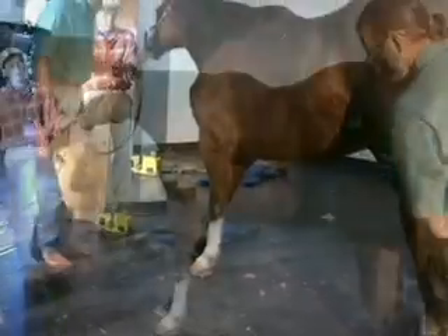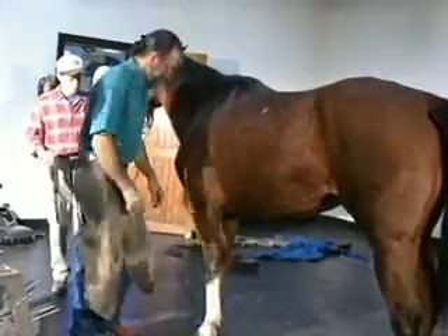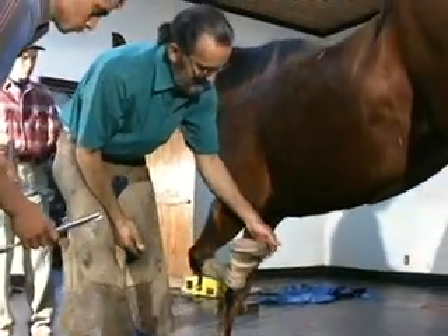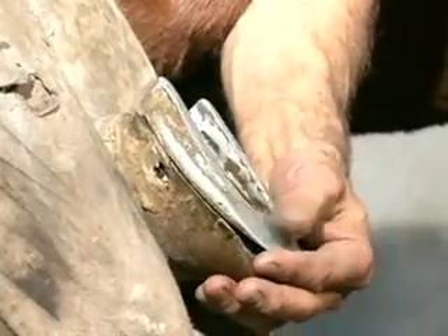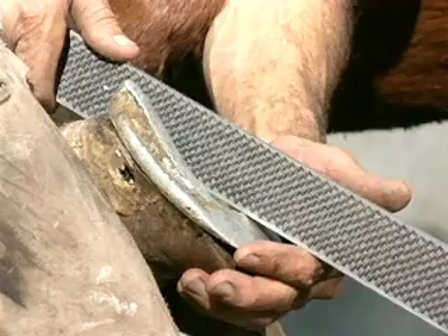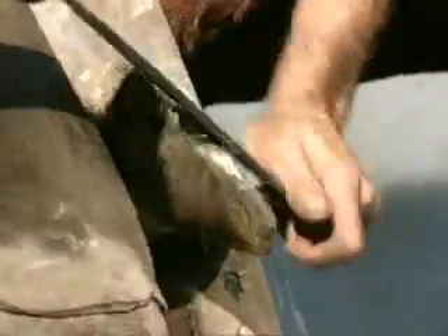Once you've got the first foot shod, I will position the horse so that they can stand directly over the foot. They don't want to do that — pinch the little chest until you notice how I did that; it will help you to pick up most all laminitic animals. Once again, the shoe goes on. I'll lay the rasp in the heel. The frog has already been trimmed. There's your guideline — that is your derotation trim. I'll trim from that point back.